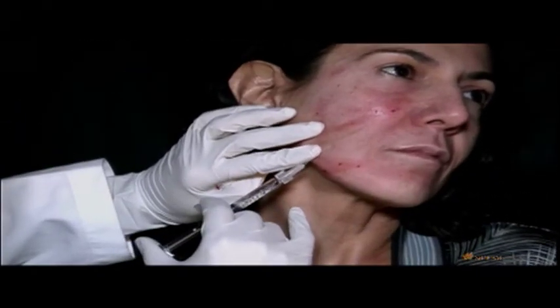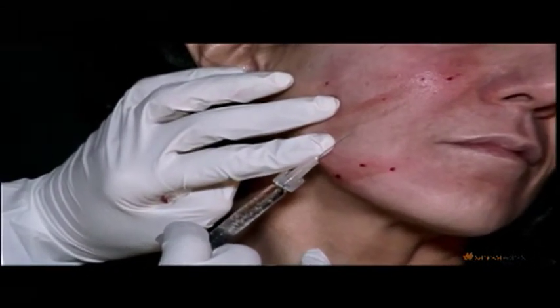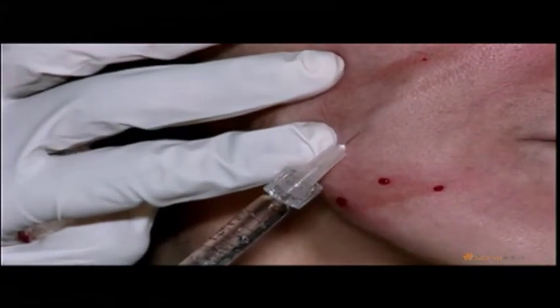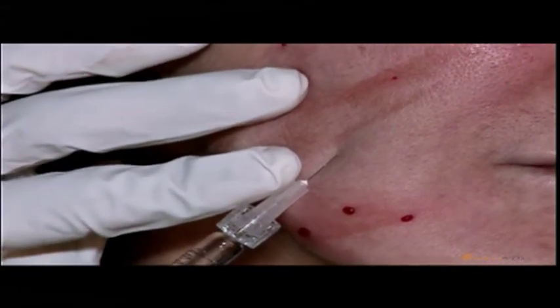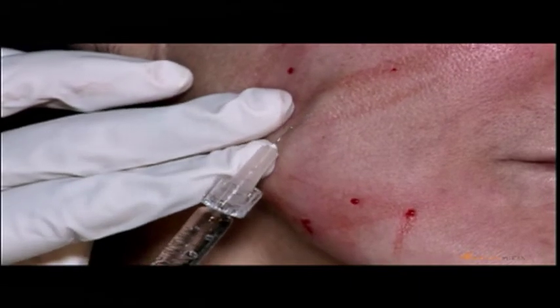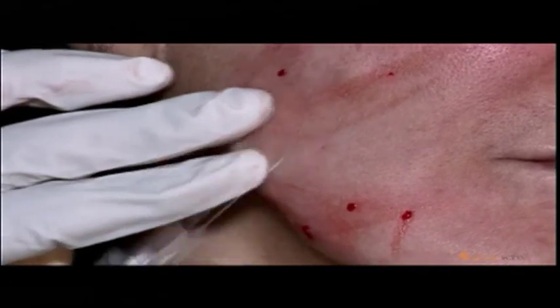We'll see it again. I'm going to be filling in for Dr. Fitzgerald tomorrow morning doing another demo. She's unwell and unable to attend, and I'll be doing another demo for the young physicians and residents on Monday. And I will keep showing you the superficial volumization so you get the idea of how acute this angle is to the surface of the skin.